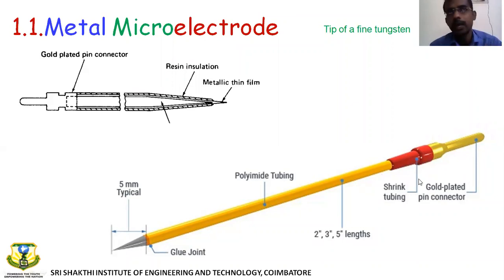So that's why in a cable, whenever it is gold plated, it could be an AV wire, audio video wire, it is costly. A normal AV wire costs around 200 to 500 rupees. A cheaper one costs from 50 rupees. So gold plated is just for better conductivity, because the signals picked up will already be in microvolts. So this is the metal micro electrode.